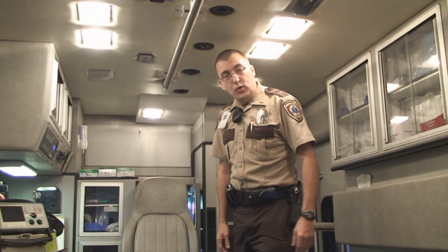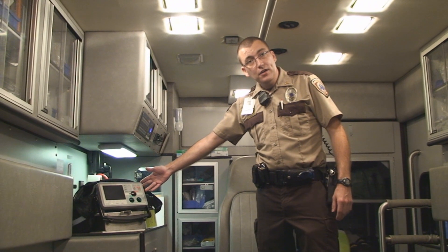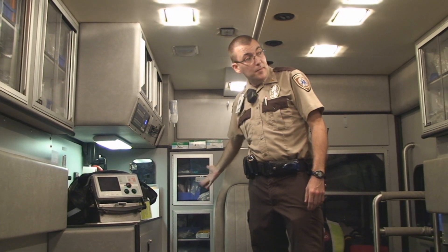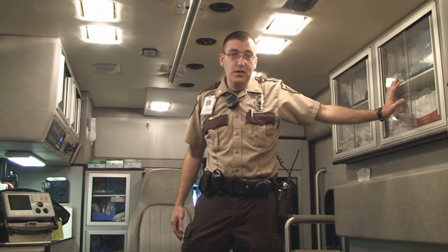My name is Riley, I'm Dave's partner. In the back of the ambulance we have a number of pieces of equipment and supplies for saving people's lives. Here we have the cardiac monitor for helping people that are having heart problems. Here we have our oxygen supplies for helping people that are having breathing problems. Up here are all our trauma dressings and bandages for people that are bleeding.